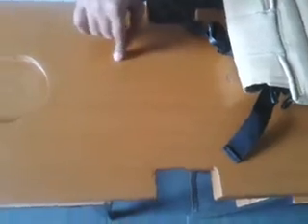The main assembly of the design is centered on the board that supports and secures the patient during application of chest compressions. The board is machined from neem wood, which is a suitable material considering its high impact strength, machinability and cost effectiveness. The dimensions of the board are 24 inches length, 16 inches breadth and 3 inches width. The motor and the belt assembly are provided underneath the board.